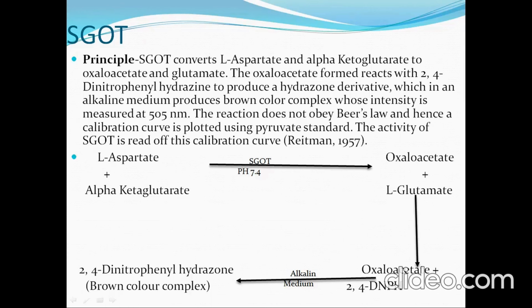The reaction does not obey Beer's law, and hence the calibration curve is plotted by using pyruvate standard. The activity of SGOT is read off this calibration curve.